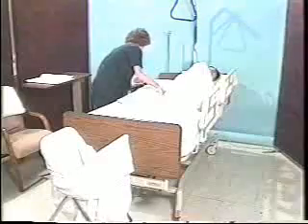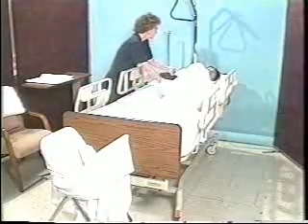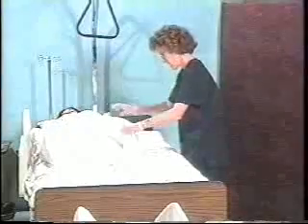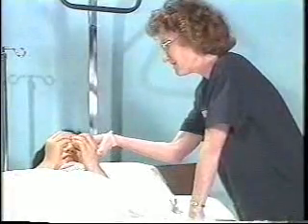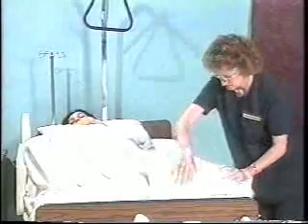Then she raises the side rail and assists the patient to move to the other side of the bed over the hump of linen. She makes sure that the patient does not get tangled up in the bath blanket. She loosens the bottom linen on the other side and checks for personal items such as dentures, glasses, or rings that may have been left in the linen. She then rolls the soiled linens away from her and discards them in the laundry hamper, holding them away from her uniform.